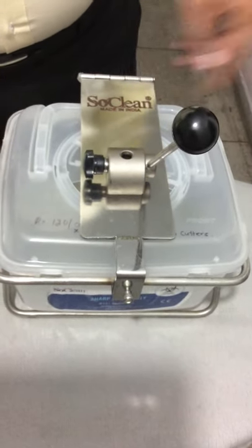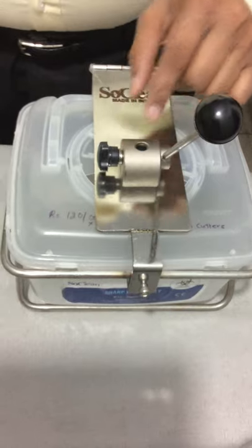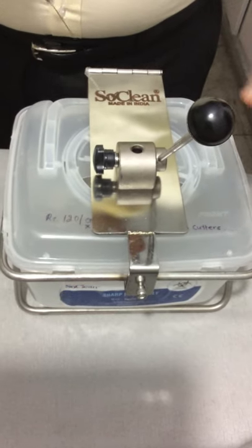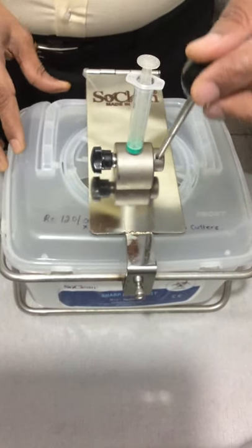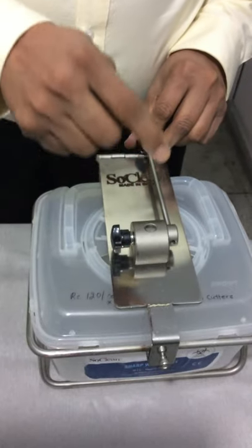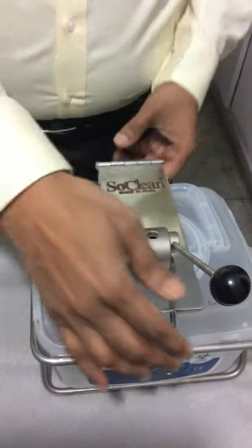You can see there are two parts. One part is the cutter, which is made of steel. You take the used syringe and needle, put it inside, and pull the lever — it will cut both the hub and the needle. The cut pieces then get stored inside.